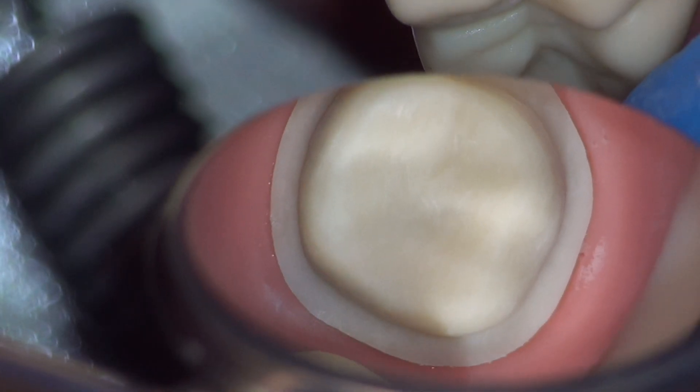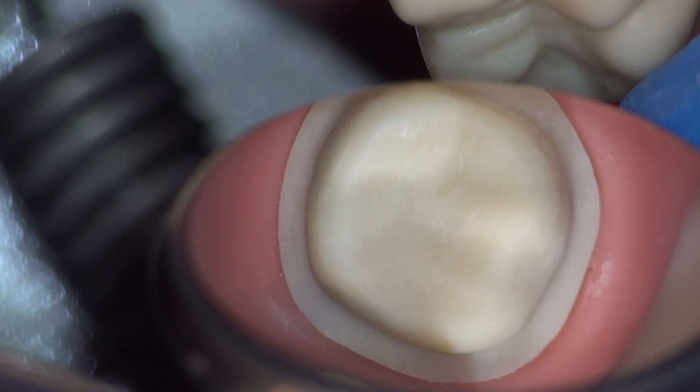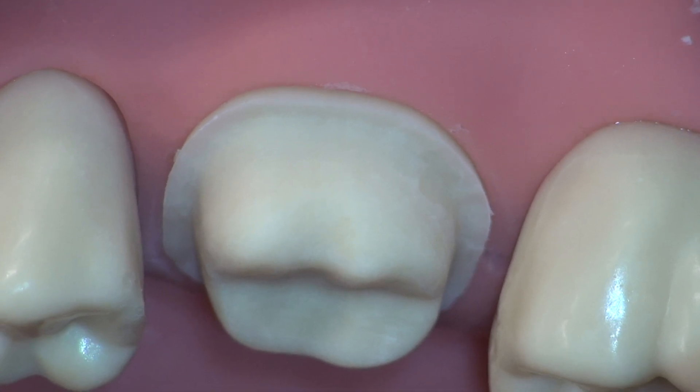After completion of your crown preparation, ensure that there is a good path of insertion for your temporary — no undercuts — and a clean prep with well-defined margins and no debris.